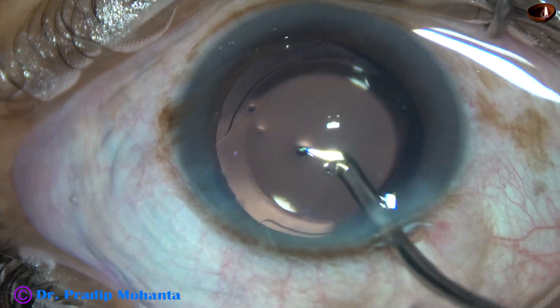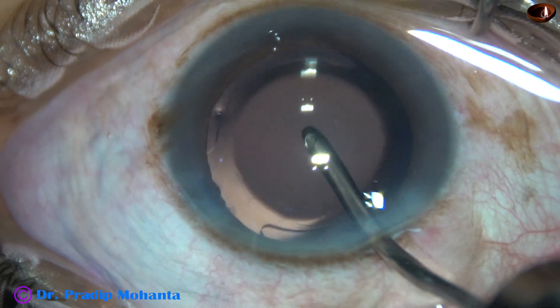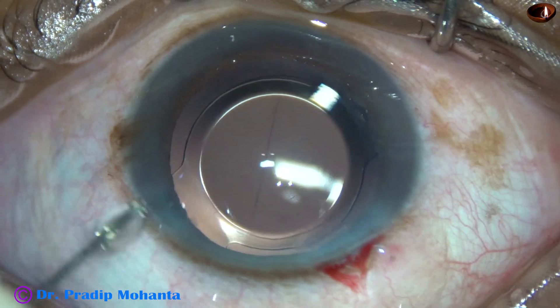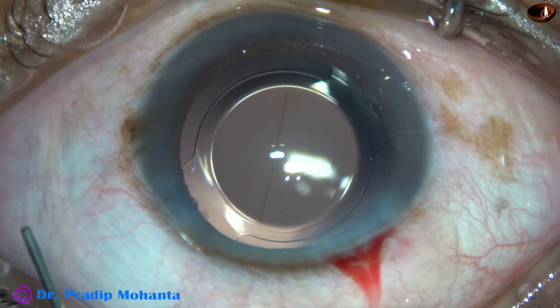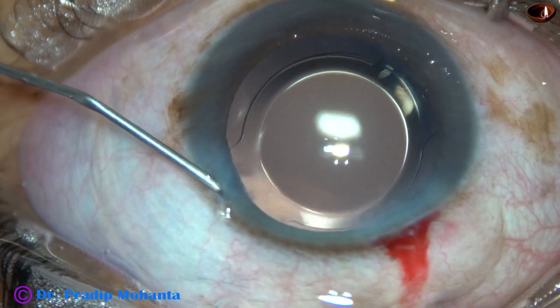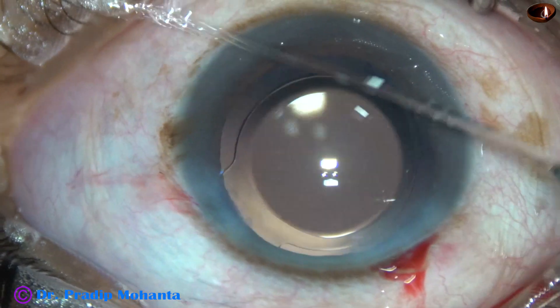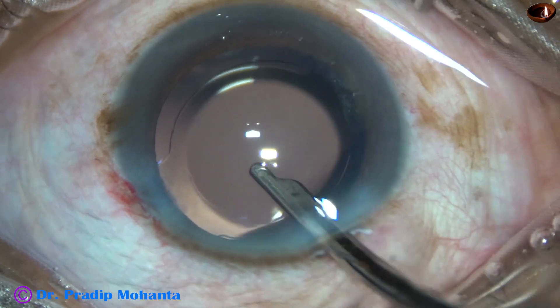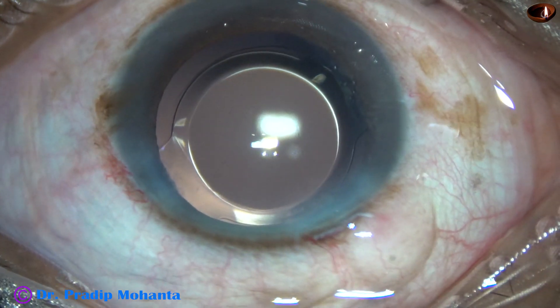This is implantation of a single piece monofocal intraocular lens. This is a very nice technique for soft cataracts — you can call it Mohanta's Lens Tilt Technique, MLTT. The side port is closed by hydrating corneal stroma, a final lavage of the anterior chamber is done with BSS, the anterior chamber is nicely formed and the case is concluded.